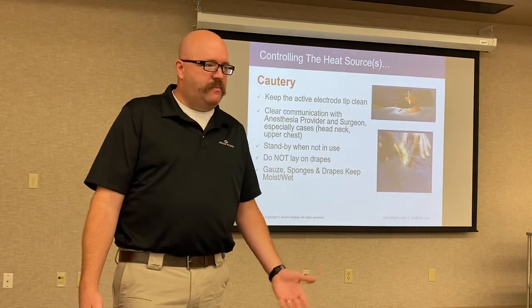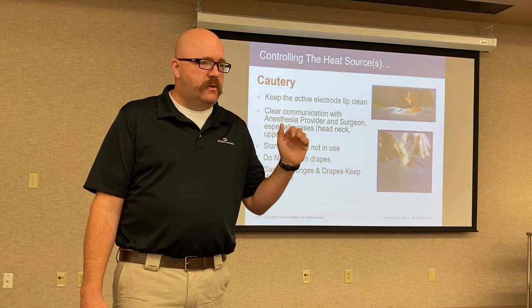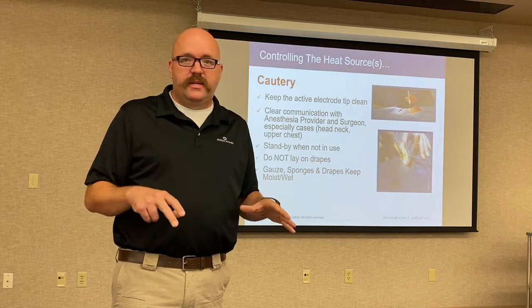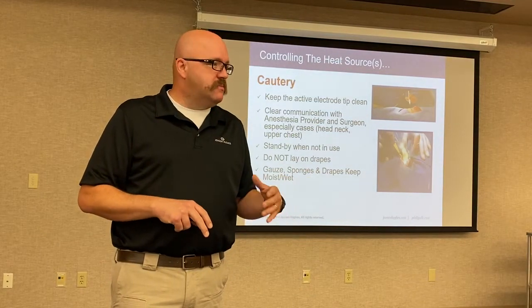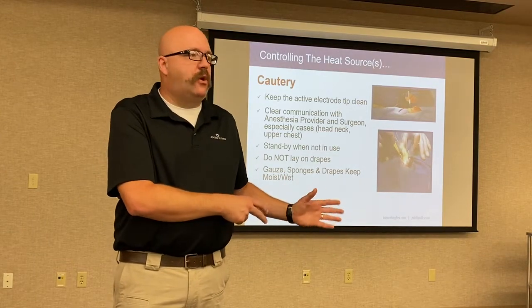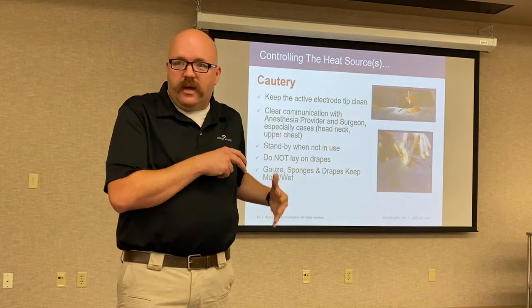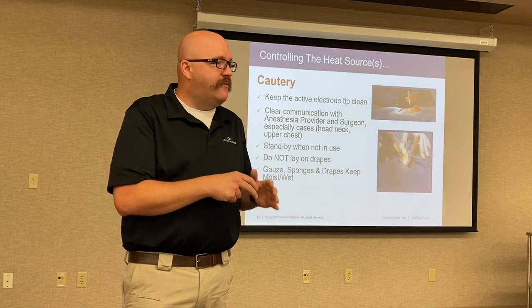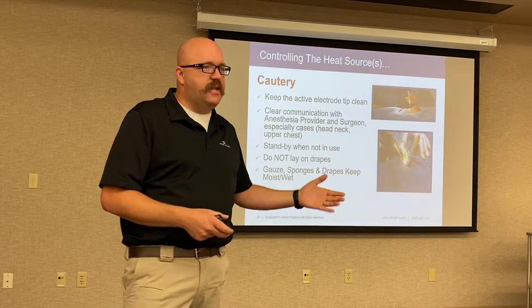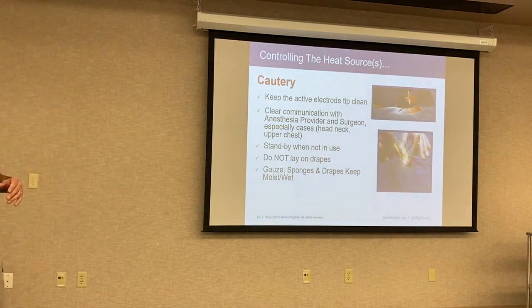I don't know why we would need to have a policy on it, but if you're utilizing a laser, you use lasers here. So if you use lasers, you keep the area around the site wet, right? And I'm also told by some senior nurses that if it is a high-risk case, they'll have their water literally close by. Not within the corner of the room, but almost attached to their hip. That way, if there is a fire, I can simply utilize the water instead of trying to run for a fire extinguisher or find another blanket or whatever it might be. You have the water available to you.